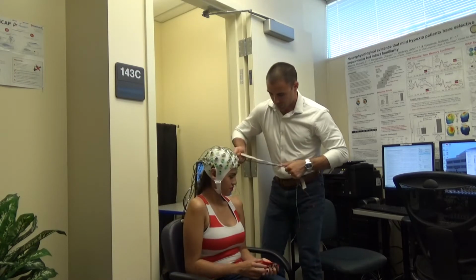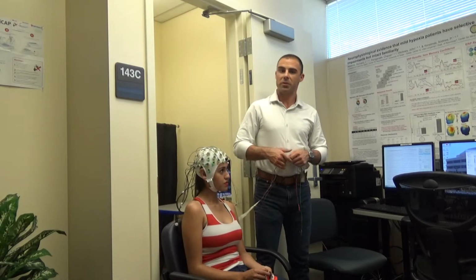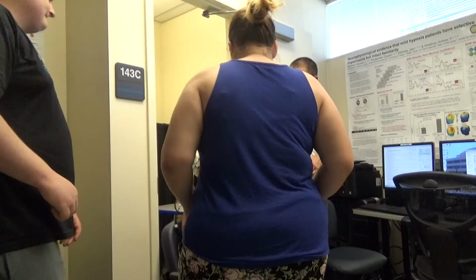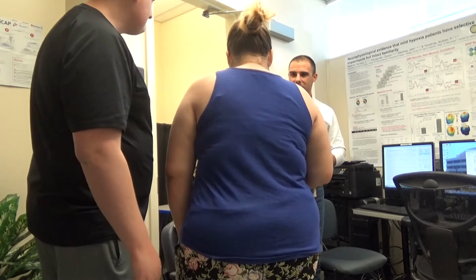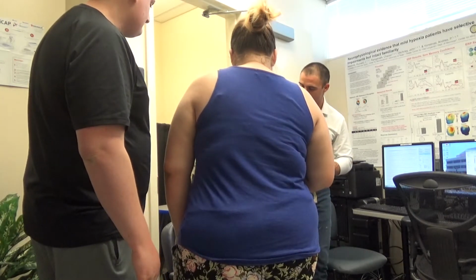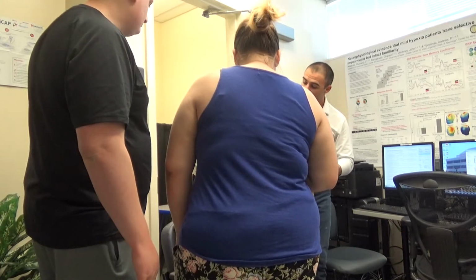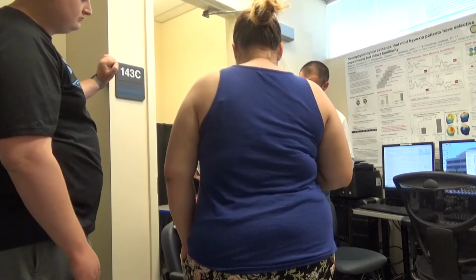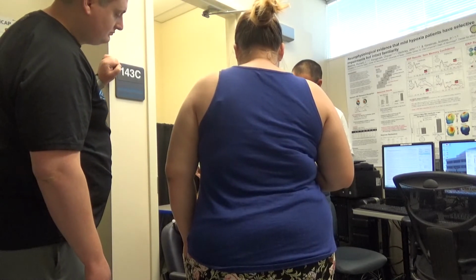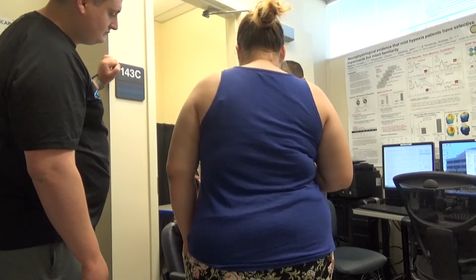Okay, so you can move around a little bit. Anybody want to help me start taking some of these electrodes off? Okay, come on over. The first thing we want to do is take off the face ones, and a lot of times they can be kind of like a band-aid to people. That can hurt a little bit. So you're going to tell them first, hey, you probably forgot, but we've got these electrodes taped on your face. We're going to have to take them off. It might hurt a little bit like a band-aid, so we can take them off if you want, but if you want to do it, you can pull them off too. You kind of guide them, there you go. And then I'll hold that for you.